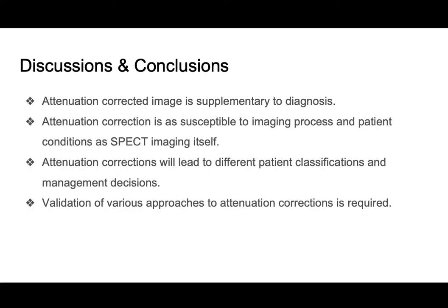At the end, the papers review several points about future work and the things to take care of while doing the attenuation correction. The first one is that the attenuation-corrected image is only a supplement to the diagnosis. You will also need a non-corrected image as a reference. And attenuation correction can cause a lot of artifacts, as can SPECT imaging itself, so it needs extra caution.